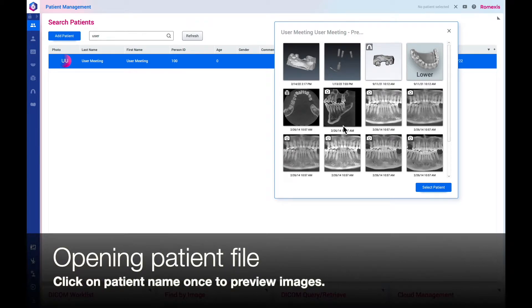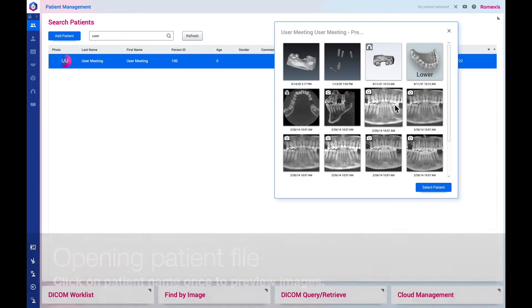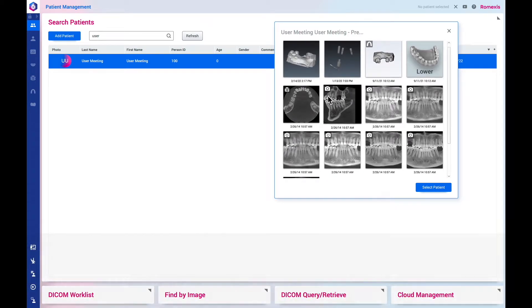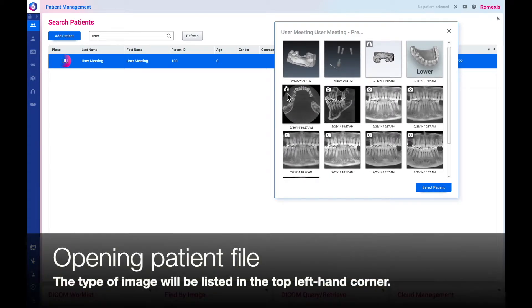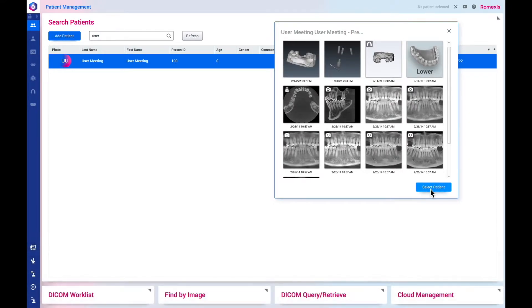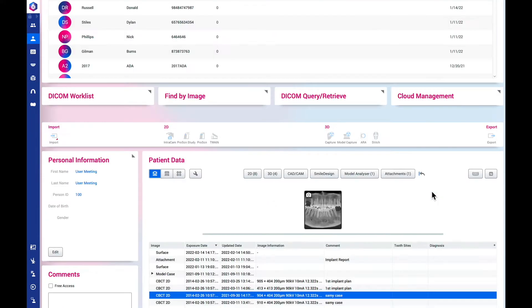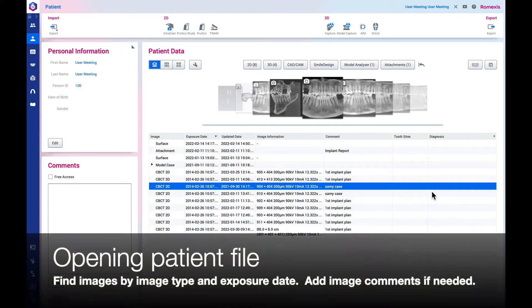Click on the patient's name once to preview the images. The type of image will be listed in the top left hand corner. Select patient. Find images by image type and exposure date.